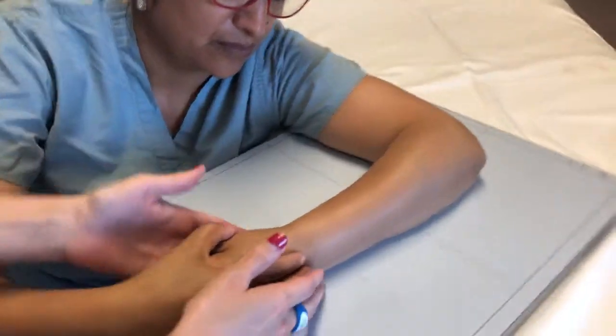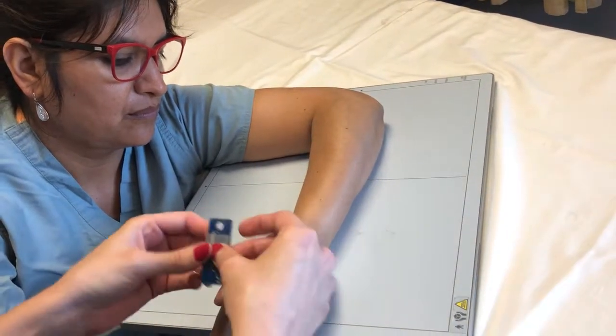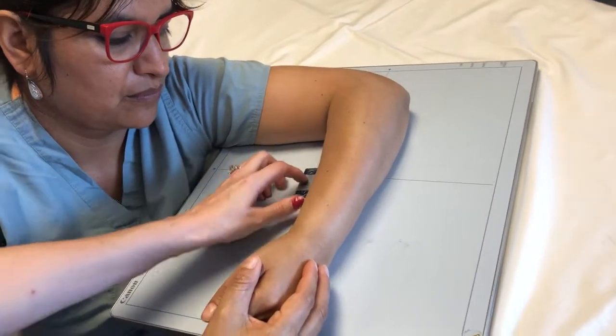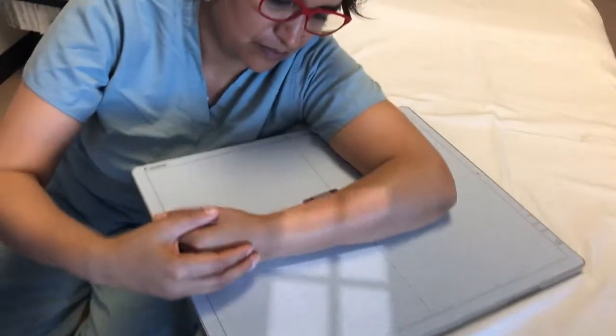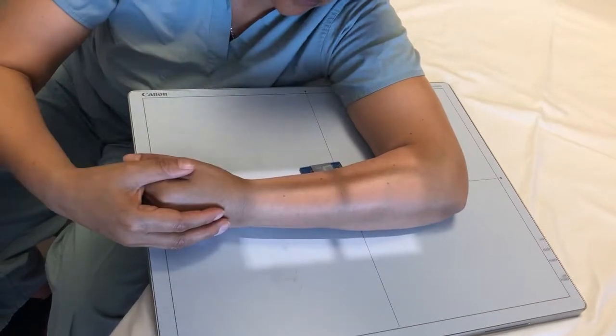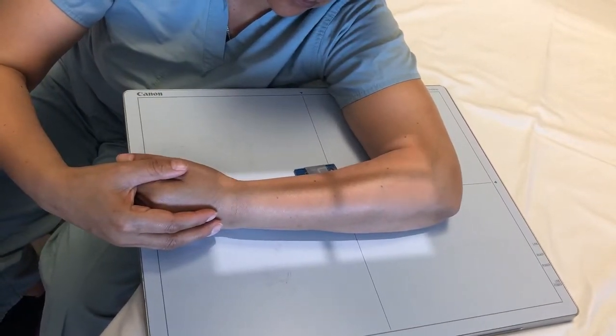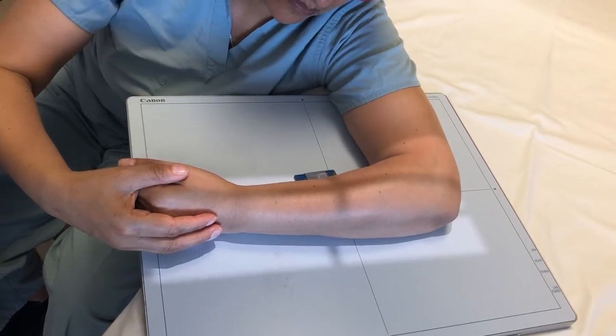Perfect. So there we go. She's kind of rotated that in. There we go. And I would take my marker and mark it on the inside. And then bringing my unit over, you place the central ray of the patient, or of the collimator light, to the mid shaft of the radius and ulna there.